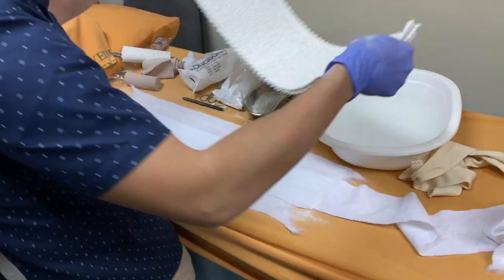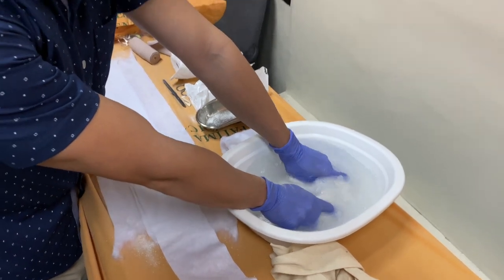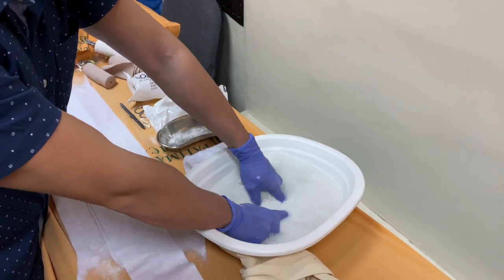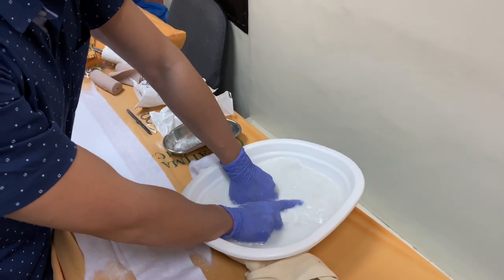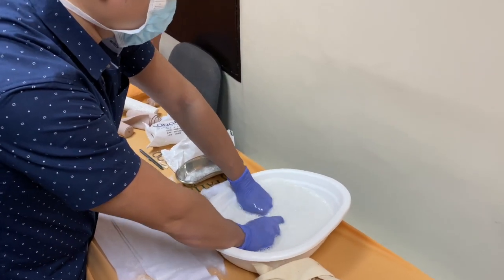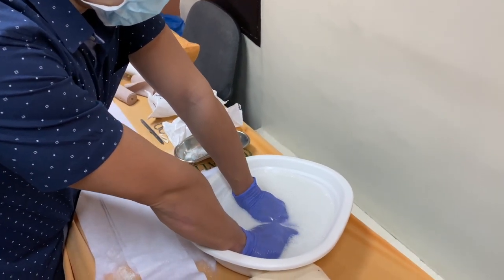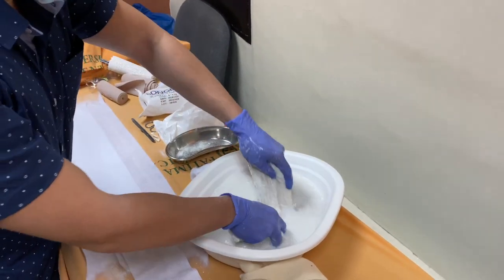Now we're ready to set this cast in the water. Make sure the water is at room temperature — around 23 to 25 degrees Celsius. If the water is too hot, the cast will set at a faster rate; if too cold, it sets at a slow rate. Submerge the cast in the water and try to squeeze it — there should be no more bubbles coming out from the cast. That means the cast is fully submerged and water has seeped through all the spaces.